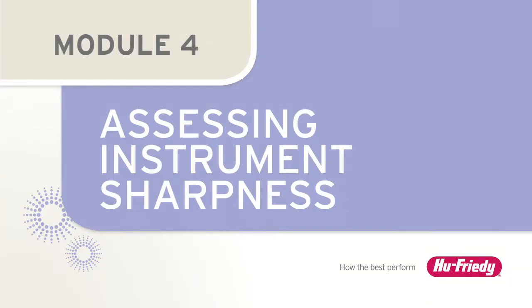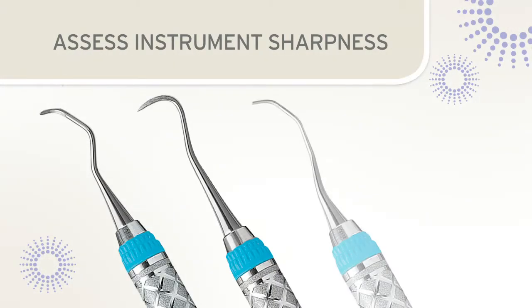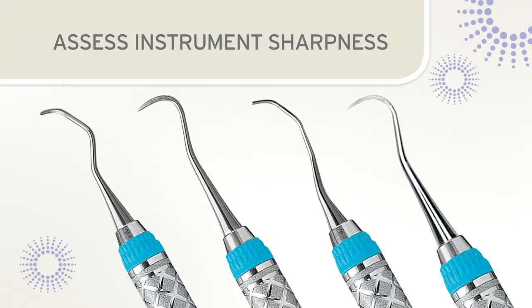Assessing instrument sharpness. The condition of the instrument blade should be evaluated both before and after sharpening. Before sharpening, the blade should be evaluated to determine the extent of dullness. Some instruments may require light sharpening, while others may need more reshaping and reconditioning.